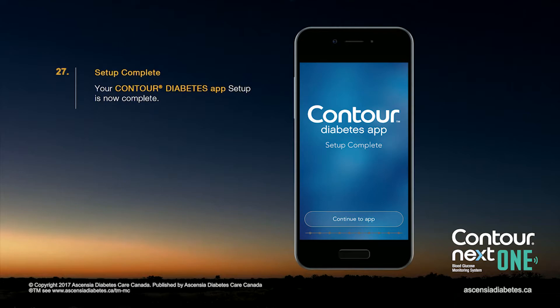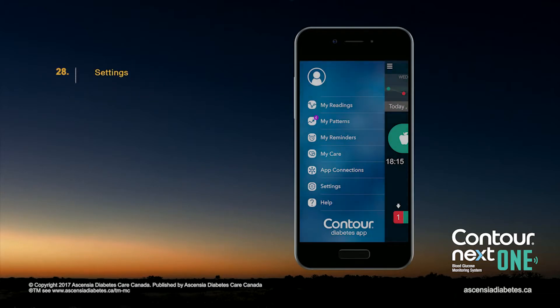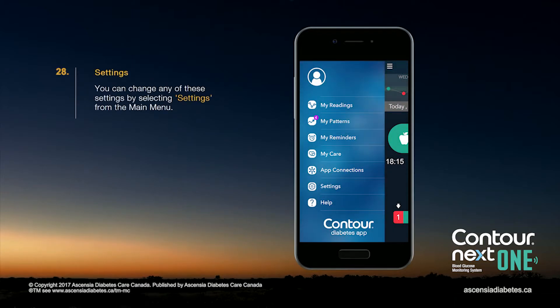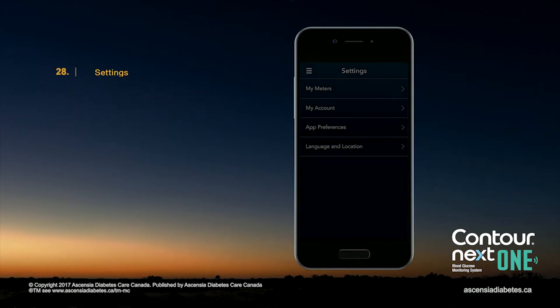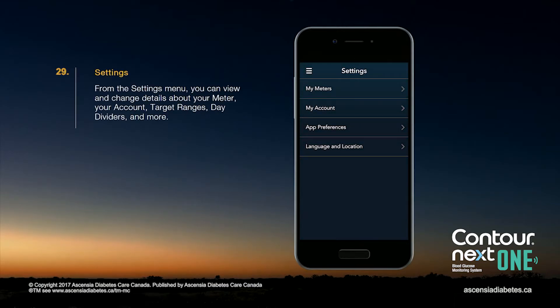Your Contour Diabetes app setup is now complete. You can change any of these settings by selecting Settings from the main menu. From the Settings menu, you can view and change details about your meter, your account, target ranges, day dividers, and more.